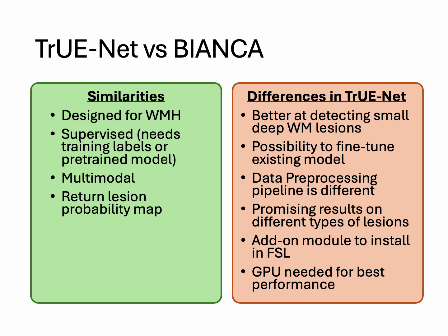TrUE-Net requires graphical processing units. For inference, you can actually run it on CPU, even though it might take quite a bit longer, maybe 10 to 15 minutes, depending on your CPU capacity and memory capacity. But if you are training the model from scratch, you definitely need a GPU card to train your model. We will see the installation instructions with the GPU specific CUDA version as well when we talk about installation.